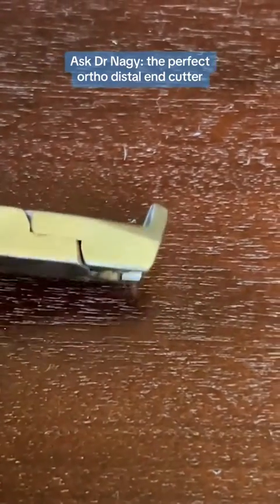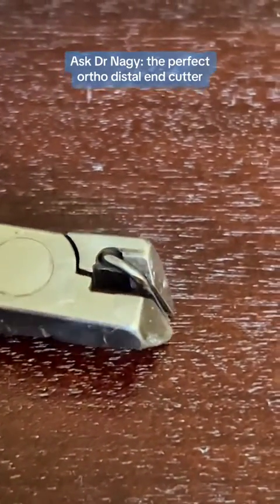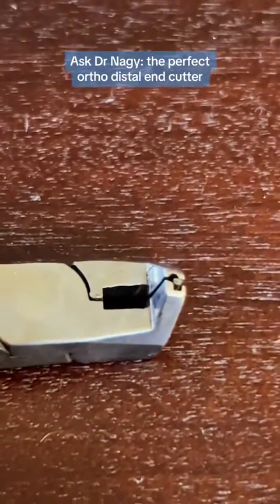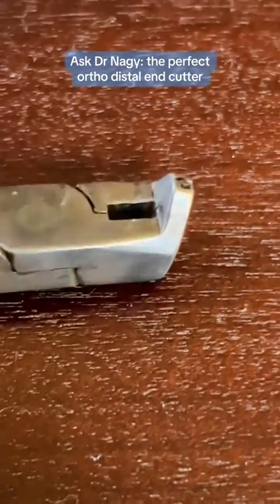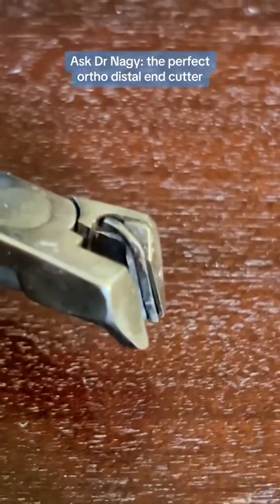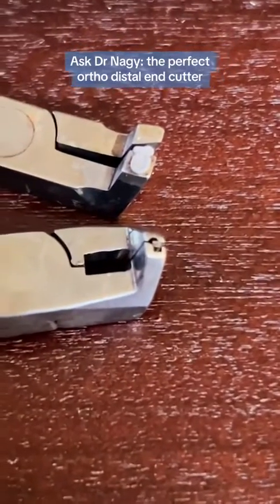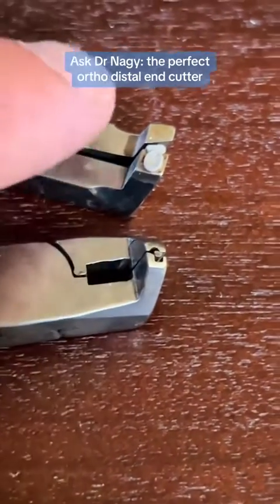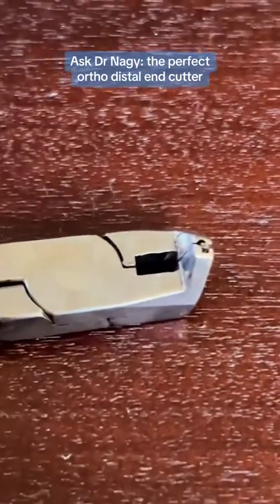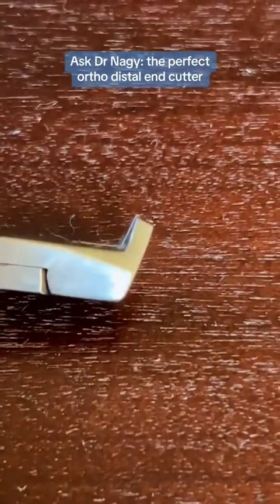So here is my favorite one. This distal end cutter has a wire that's going to hold the cut piece — see that? It also has a compact head, it's a flush cutter, and it holds the wire. This is the only one that meets all the requirements of a perfect distal end cutter. OrthoArch makes this one — probably a bunch of other companies do too, but it's very difficult to find. It has that extra wire here that holds the cut piece, and that wire can be replaced. Look at how much more compact the head is compared to that Hugh Freedy one. This meets the requirements of a flush cutter, holds the wire, and the head of the instrument is really small, so it's easy to cut the wire.